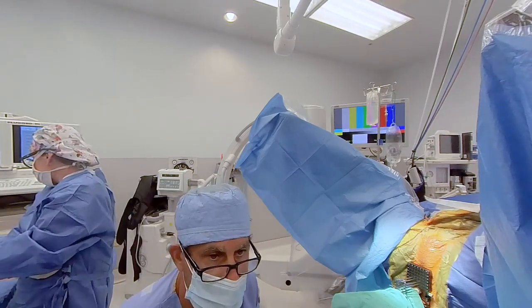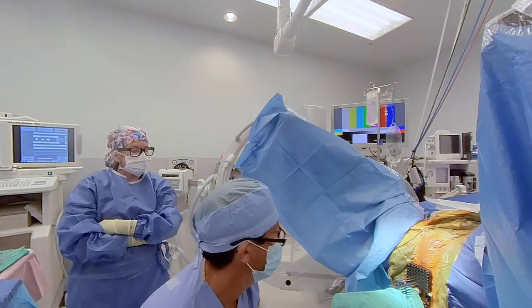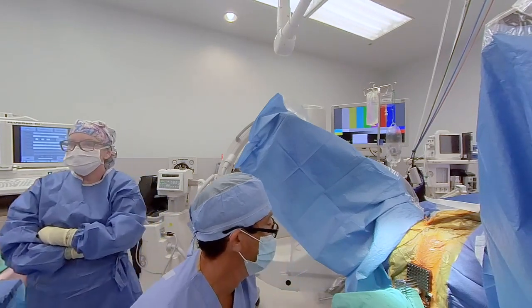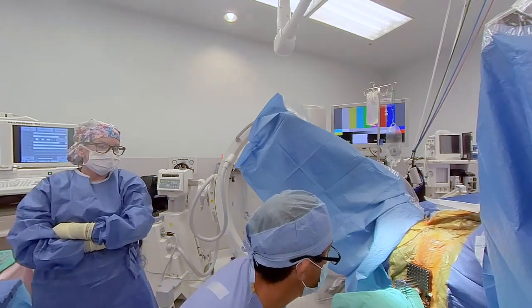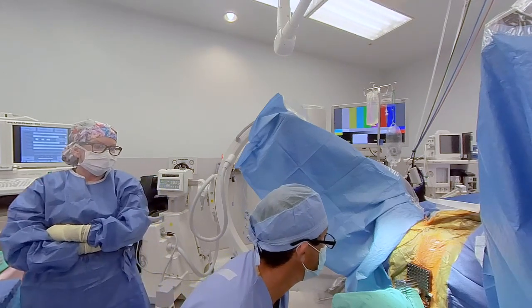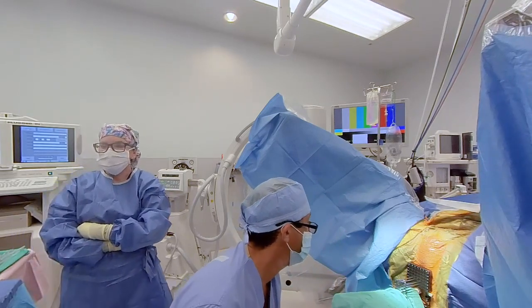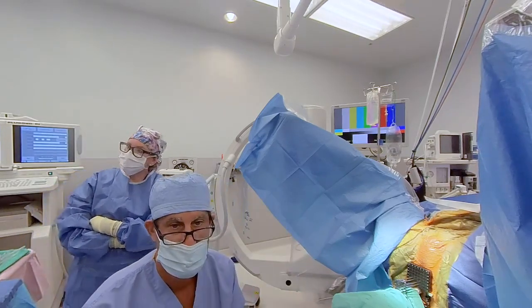Okay. First needle row is 4, Charlie prime and David prime. Next is 3.5, Boy prime, Echo prime. Next row is row 3: Big Boy, Big Charlie, Big Echo, Big Frank. Next row is 2: Big Boy, Big Charlie, Big Echo, Big Frank. Last row, 1.5, is Charlie prime and David prime. And row 1 is Big Boy, Big Charlie, Big Echo, Big Frank. That's 18 needles.